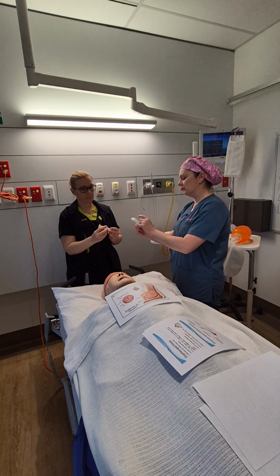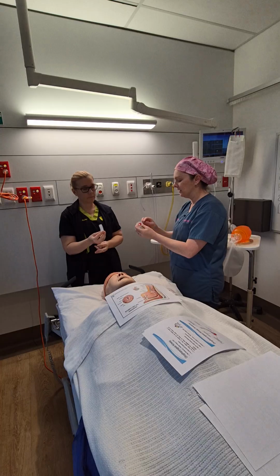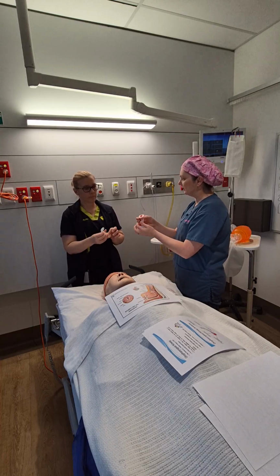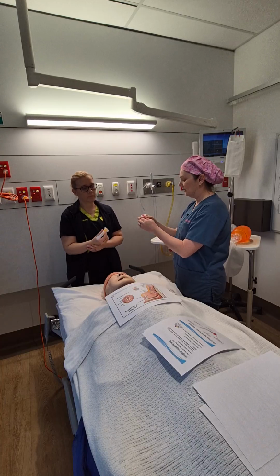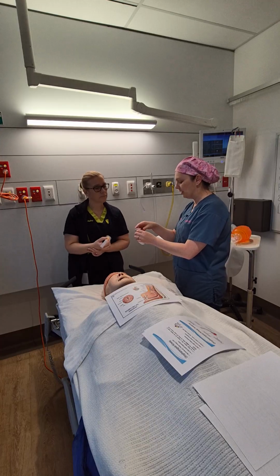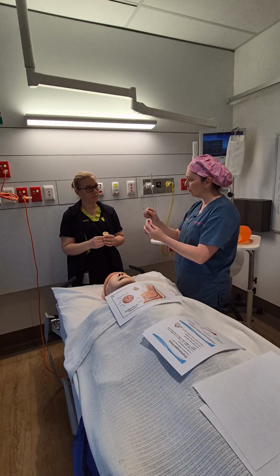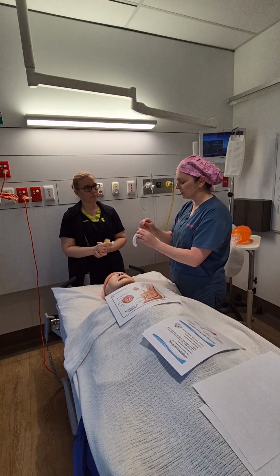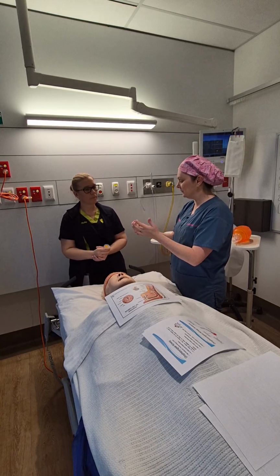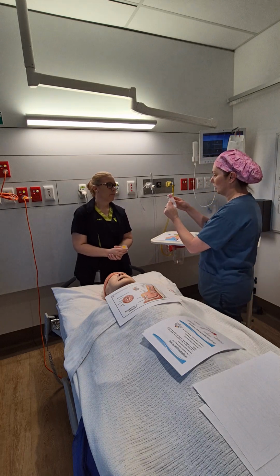It is curved. There is a little tapered bit at the bottom there, just to help with insertion on the back of the palate. There's a bit of a reinforced bite block in the middle, so if a patient wakes up or is having a seizure or something and they bite down, you're going to still have your airway because it's nice and hard. There's a flange at the top to stop over insertion. You can see that it's hollow, so if you wanted to stick a wire suction catheter down there and suck out some secretions and stuff, we can. They're color coded to make it easier, and you can see that it comes from very, very tiny to quite big.